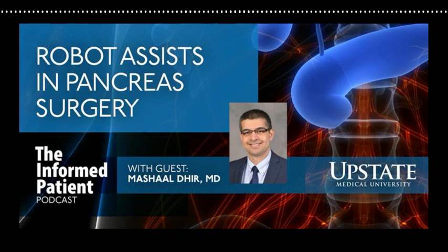How long does this take compared with open? I think you said could be 6 to 8 hours, right? Yes, and through small incisions, it could even be longer because we have to work under magnification. It's more methodical in a way that we have to make finer movements because we are in a limited space.